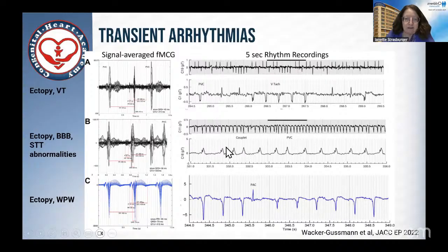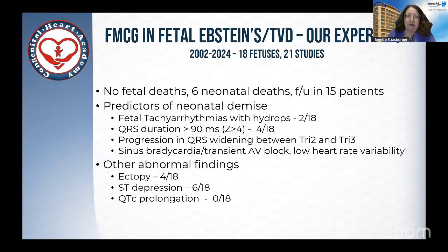Here is a patient that has some ectopy and bundle branch block and some ST segment changes. And this is a patient that has WPW. The only beat that's not pre-excited is the premature beat here. So then FMCG in Ebstein's is what I really want to talk about today.